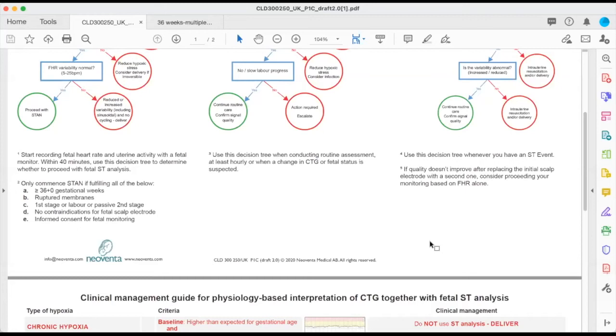Okay. In addition to that, we have no idea what the baby's ECG looks like at 34 weeks, because theoretically, if the baby is immature and the baby's functions are immature, can the membranes also be a bit more leaky? And then the sodium potassium balance may not necessarily be the same. And then the pump is trying to push things while it's leaking from the other side.